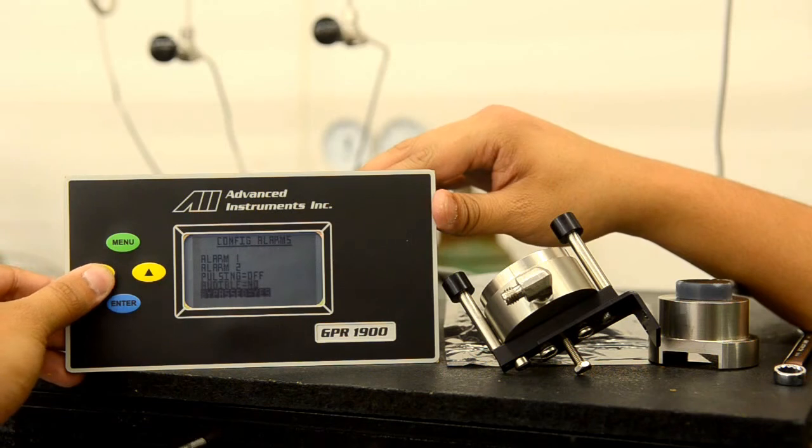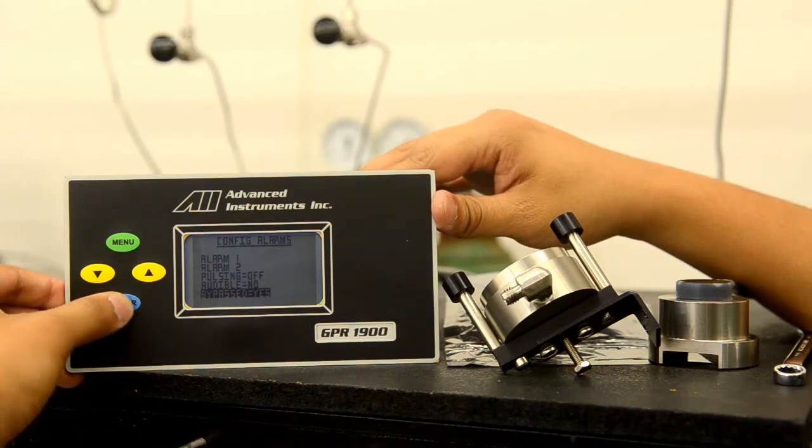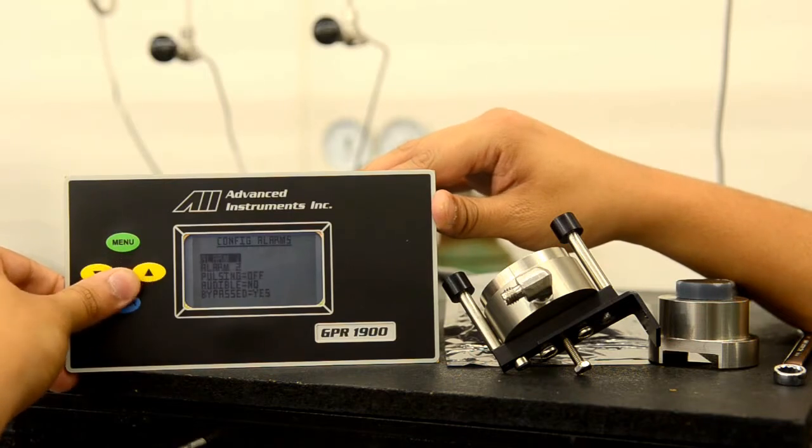We also have a bypass option. If we want both alarm one and two to be bypassed, we can hit yes on that. No to allow both alarms to be enabled. Again, this is done by selecting enter.